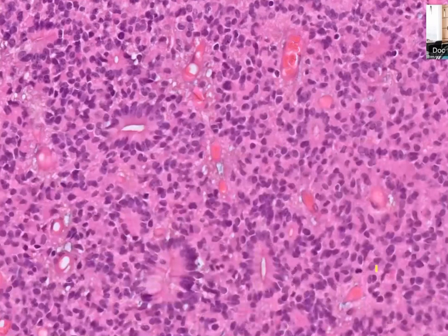So this is a higher power view. You saw that. What is this? You should describe this one nicely. This photograph shows the formation of true rosettes, and this one, how will you describe this? What is this? Describe this one. Whatever I'm encircling, describe this.